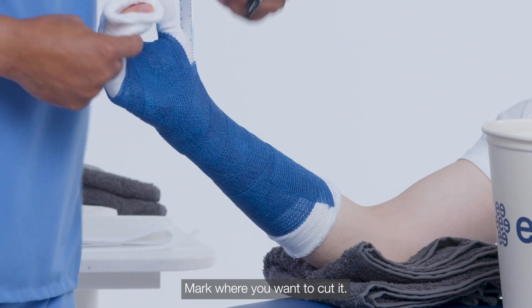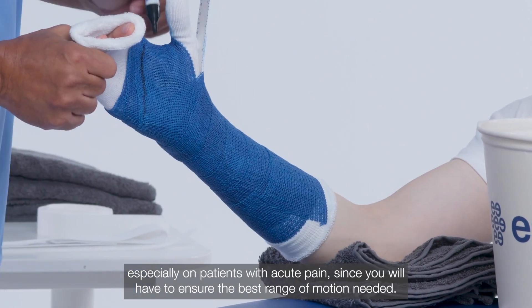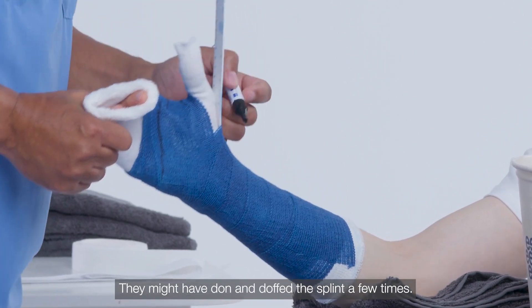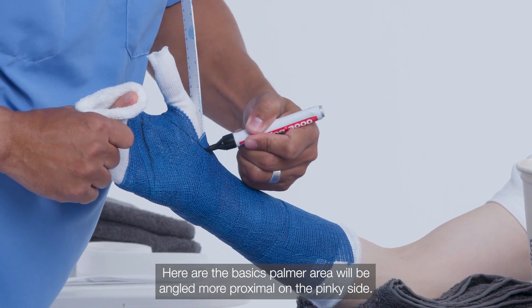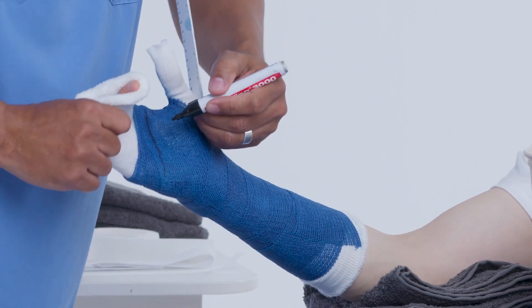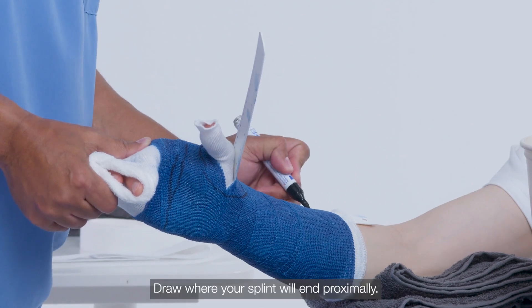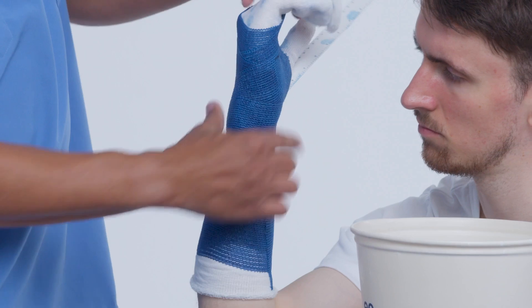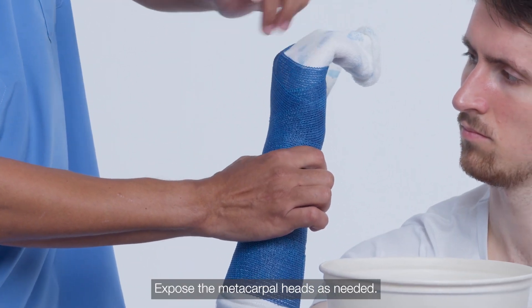Mark where you want to cut it. The markings make it easier for conservative cutting, especially on patients with acute pain, since you need to ensure the best range of motion. Here are the basics: the palmar area will be angled more proximal on the pinky side. Draw a teardrop around the thumb. Draw where your splint will end proximally. Expose the metacarpal heads as needed.